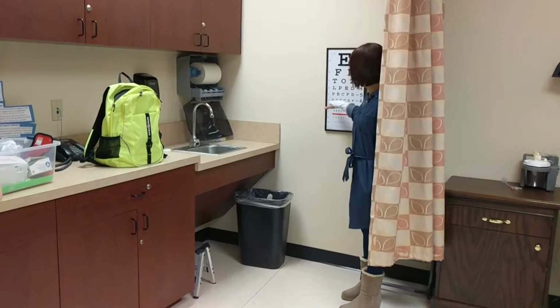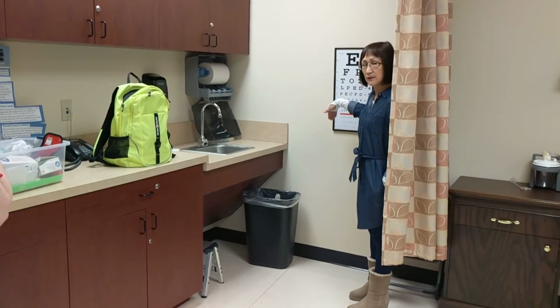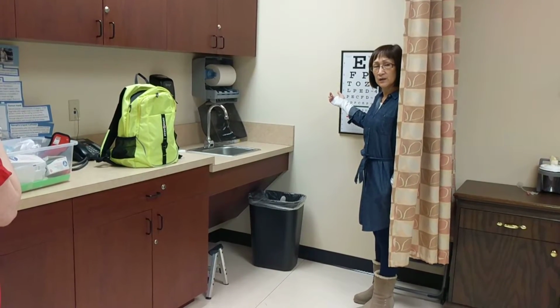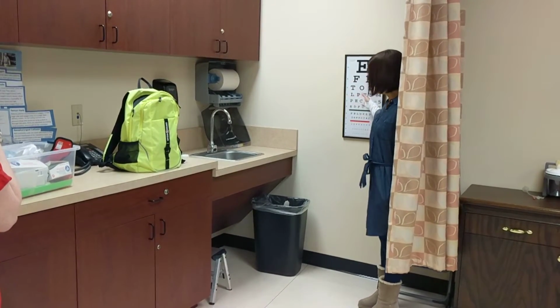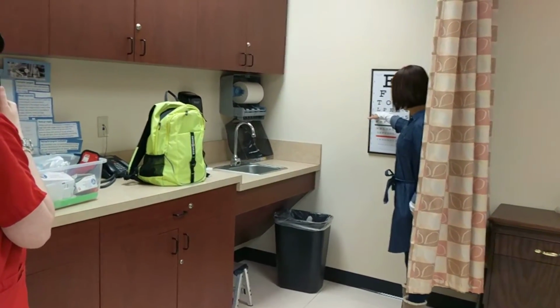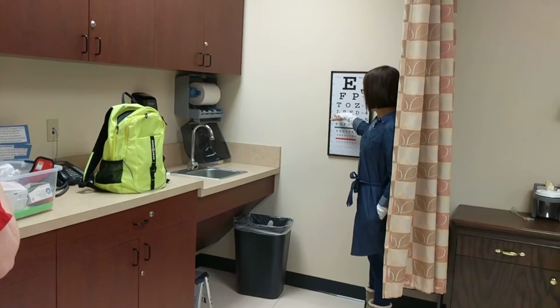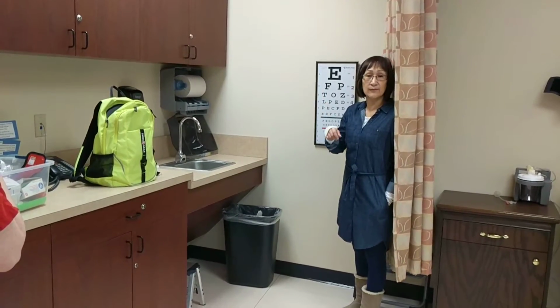But if she can, then ask them to read it, and if they're still able to get it, go down a line. Okay, so for her left eye, it would be a 20 over 40, meaning 20 feet away, she can read line 5, while those with normal eyes can read line 5, or line 4, sorry, we were at 20 over 50, so she can read at 20 feet, there's 4 letters, but comparing it to people with normal eyes who can read line 4 50 feet away.